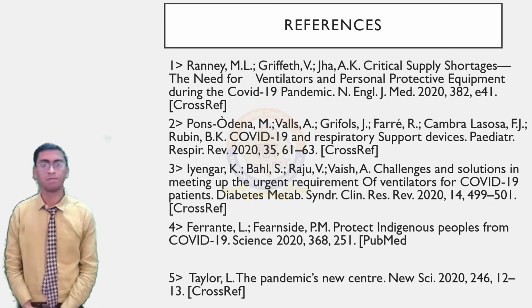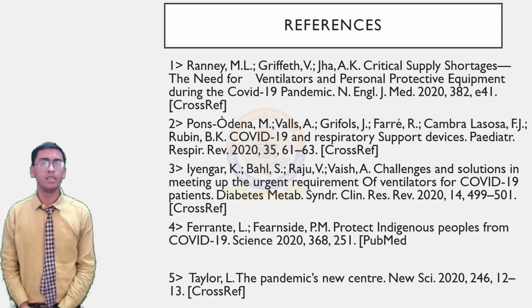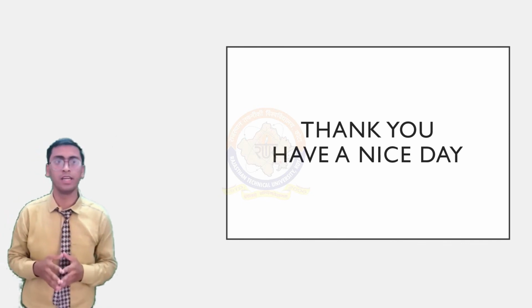Any question? Yes. What is minute ventilation? Minute ventilation. Tidal volume into respiratory rate is called minute ventilation.